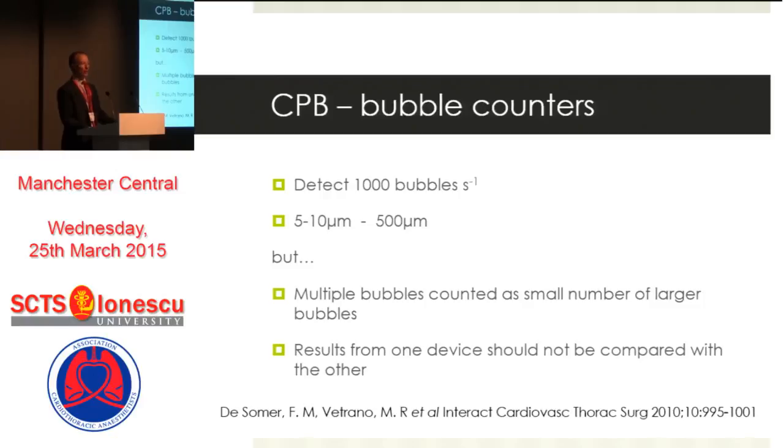But Philip de Somer wrote a very pertinent article which reminds us that large numbers of small bubbles are seen by the monitors as a smaller number of large bubbles because of the resolution of the ultrasound. And secondly, he warns us against comparing one device with another.